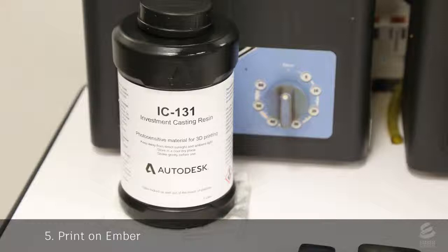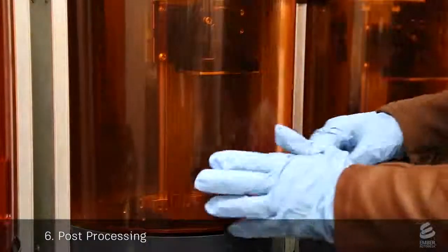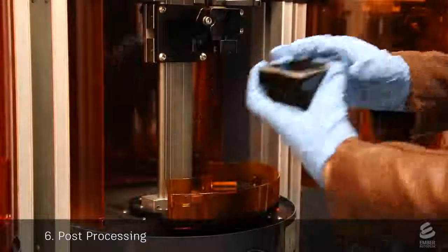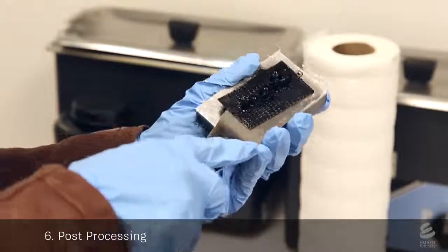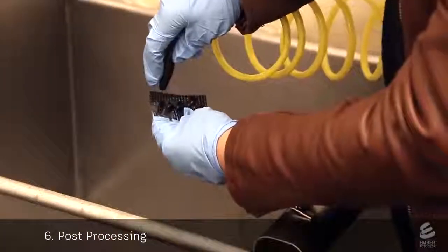Glidewell uses a specially formulated resin, which will completely burn out later in the process. After the print is done, a tech removes the build head from the printer, scrapes off the print, washes it in alcohol, and dries it with an air gun.